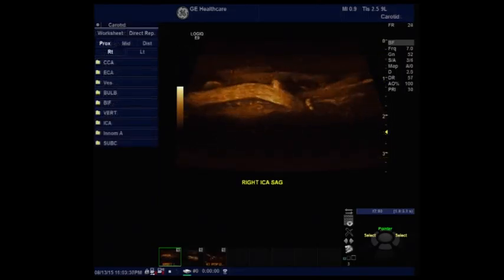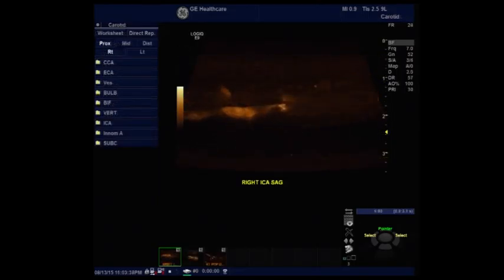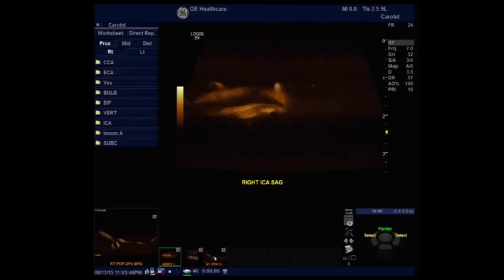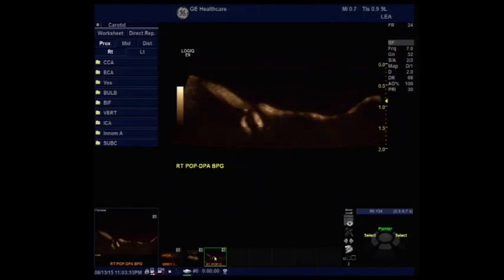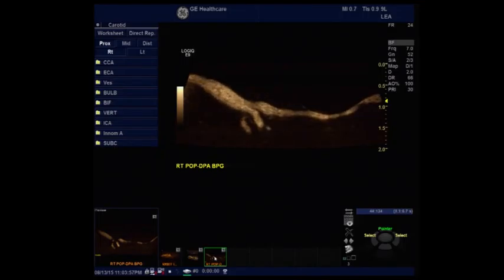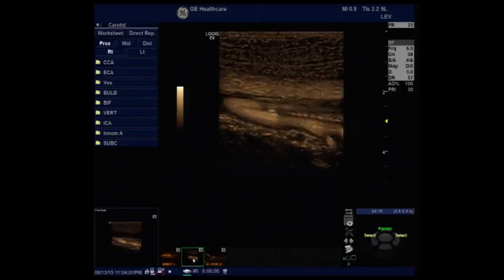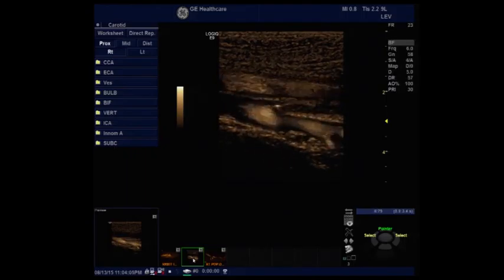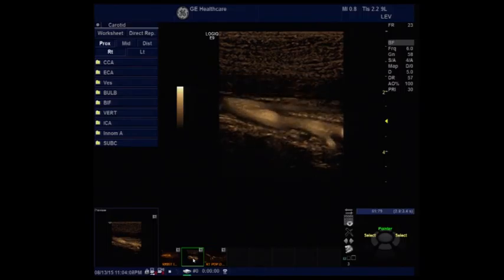B-Flow can be used when assessing hemodynamics. In this carotid stenosis, the hemodynamics are clearly seen, and the true vessel diameter is visualized. When looking at a fistula or bypass graft, B-Flow adds the extra advantage of excellent spatial resolution when evaluating the flow. Slow, spontaneous flow in the venous system may be seen due to the detection of the weak echo signals of the red blood cells.